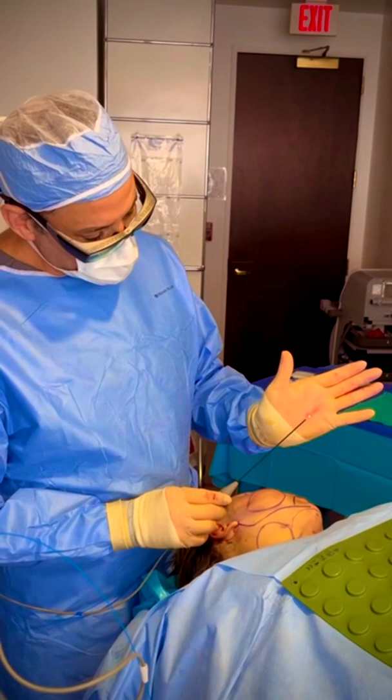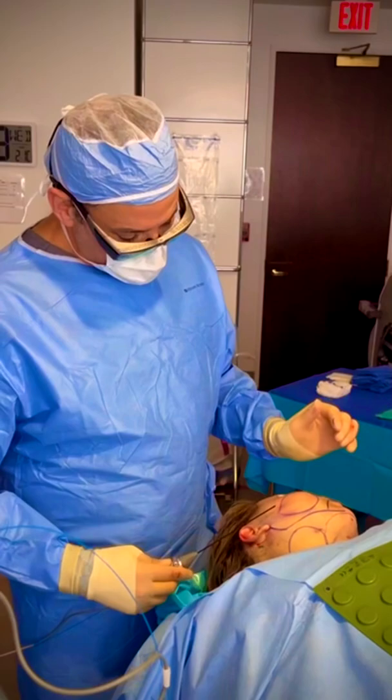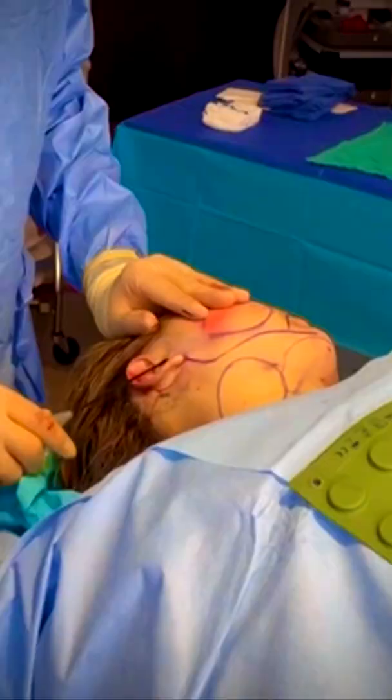So what we're going to do now is treat the patient with the Precision TX laser. This is a directional laser, which is really cool. This laser fires — as you can see, it's lighting up my hand. We're going to pretend this is the undersurface of the skin, so you'll see the light coming up through the skin as we treat her. We're going to treat the mid-face and lower face area first. Here we go — you can hear it popping. See that nice light under there? That's the laser beam firing underneath the skin. This heats the skin and helps condition it so she'll get new collagen and it will tighten.